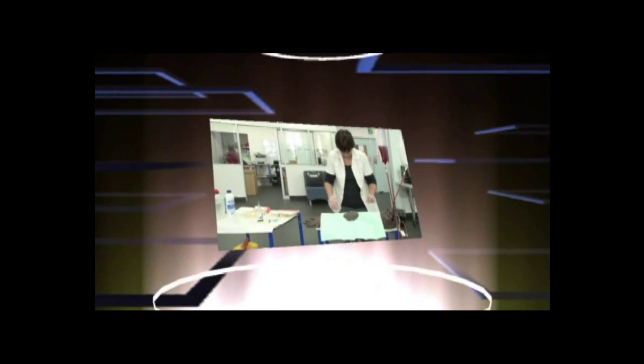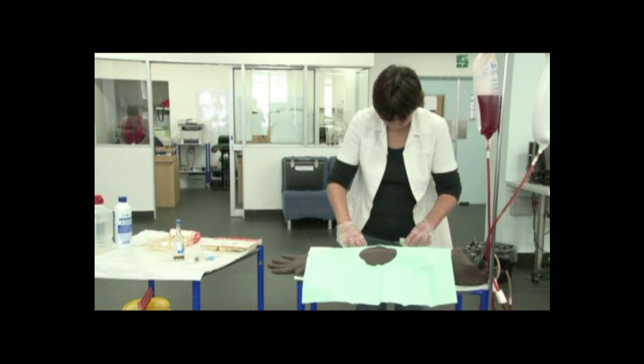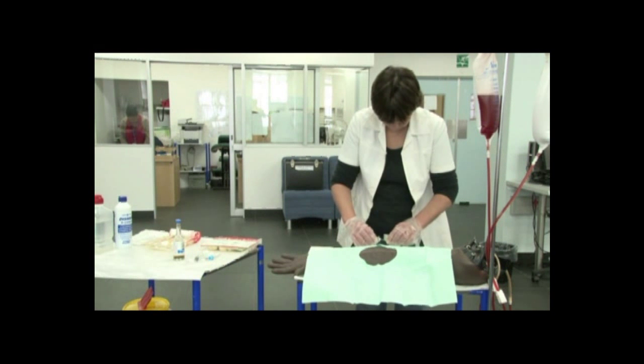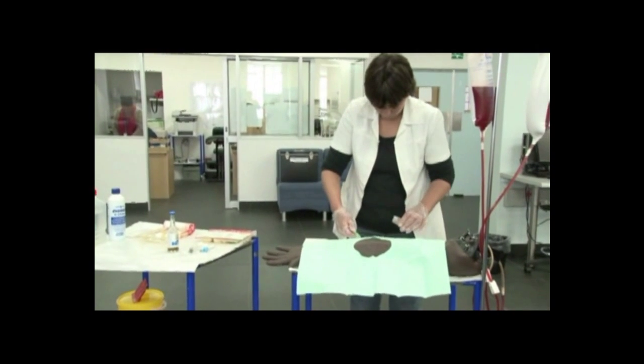When using a bulldog to do a blood culture, be reminded that the bulldog is not sterile. You are required to clean the entire bulldog and make sure it is disinfected and then dropped onto the sterile field.